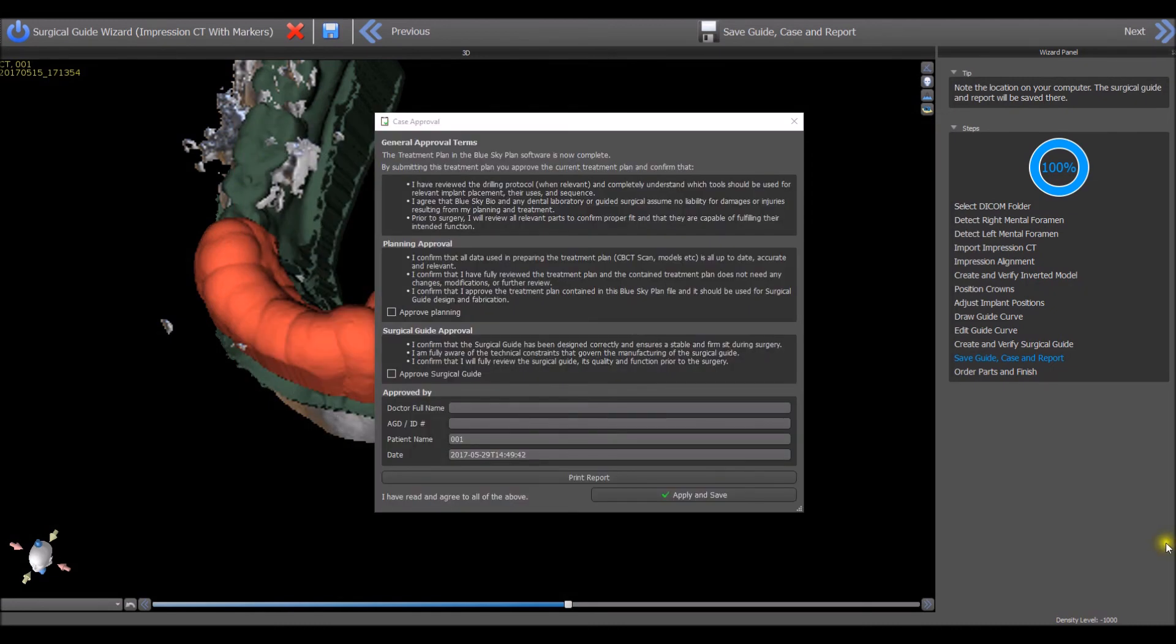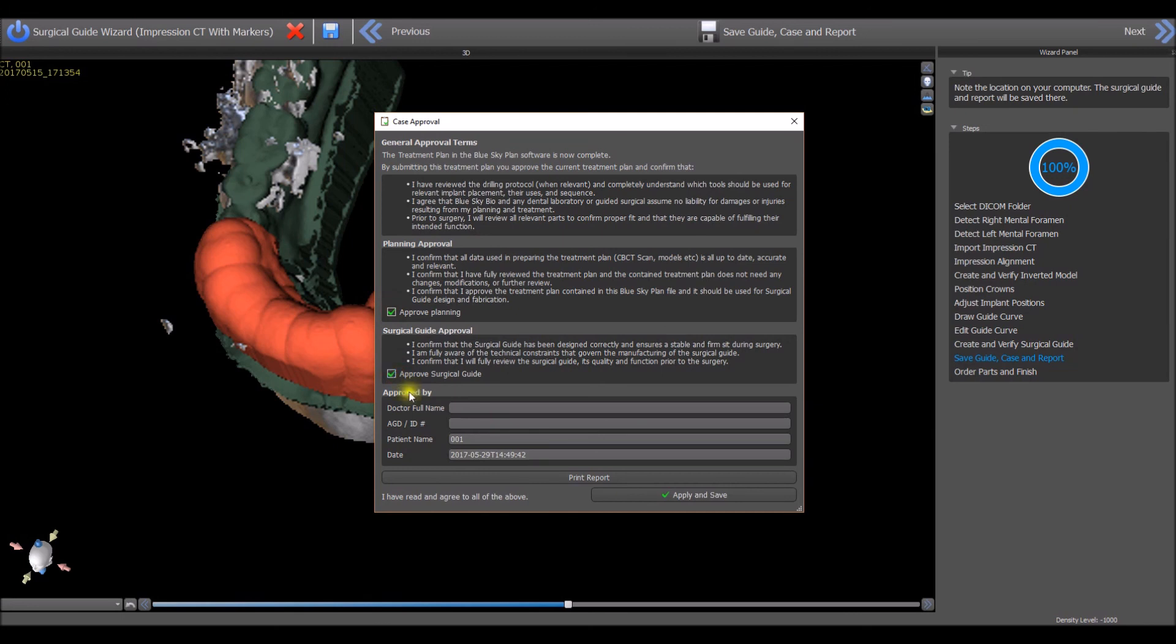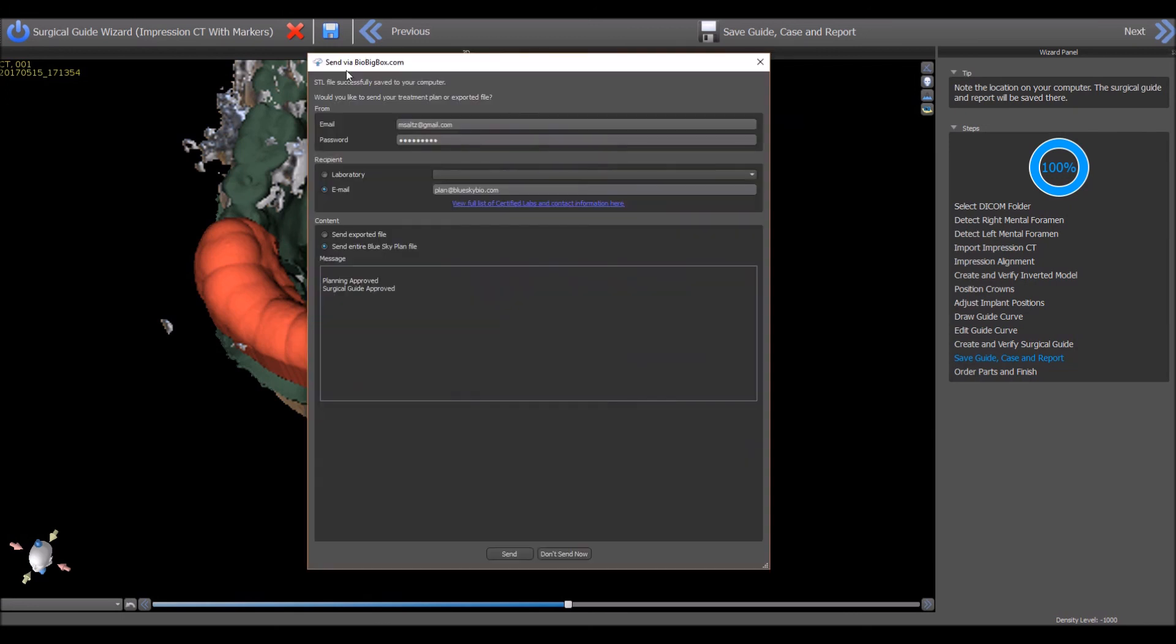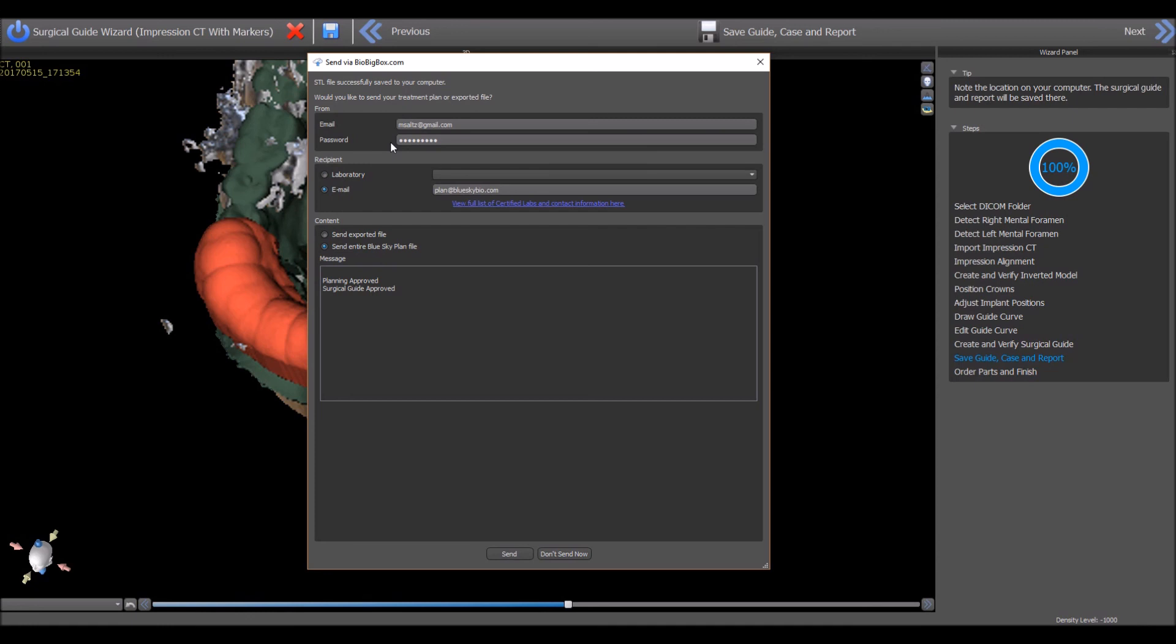If you are going to be sending the digital treatment plan or the digital surgical guide for surgical guide fabrication, complete the approval form and then press apply and save. Use BioBigBox.com, BlueSkyBio's HIPAA compliant file transfer system directly from within BlueSkyPlan to send the treatment plan or the surgical guide to a dental lab or any email recipients. If you do not yet have a BioBigBox.com account, create one free at BioBigBox.com by entering your email and creating a password. Once you have created your BioBigBox account, enter the BioBigBox email address and password into the relevant fields.